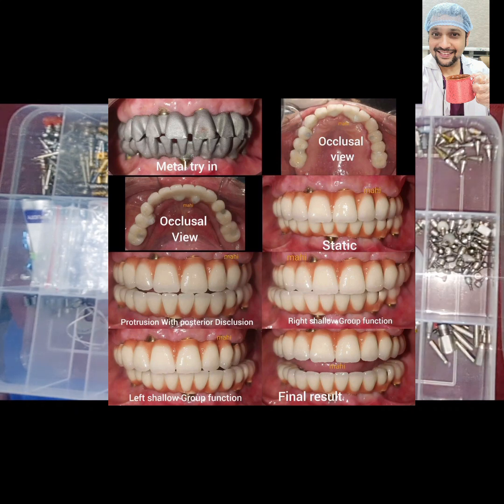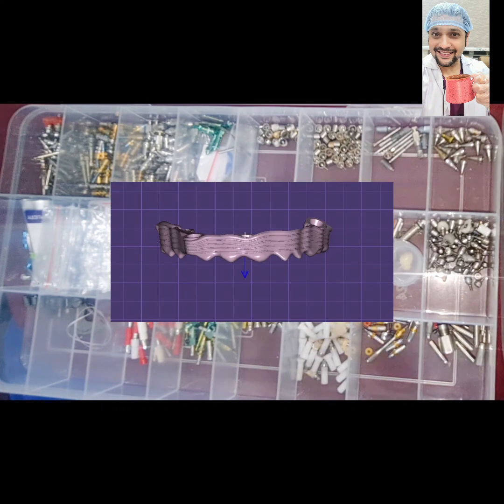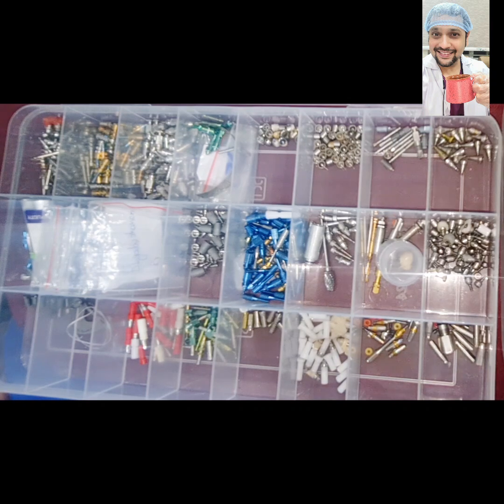All that it is, it cannot be explained here, but the basic is you get a framework which can be layered with ceramic, or you can always use the framework on which the superstructure can be luted on. Different frameworks: cobalt chromium can be used as a framework, zirconia can be used, titanium can be used, PEEK can be used. You can just go back and read about it, but understand that on MUA level, the prosthesis is a framework.